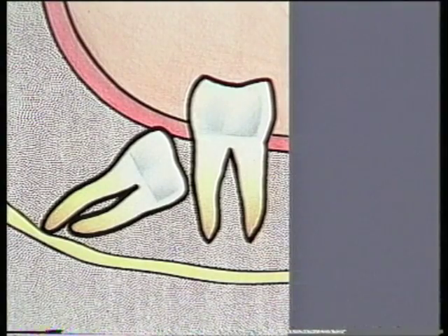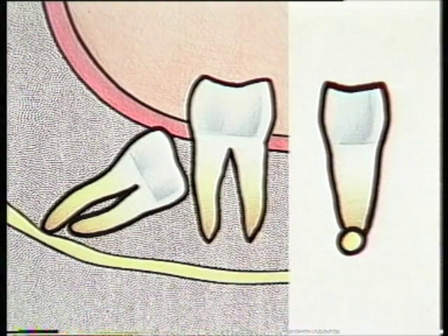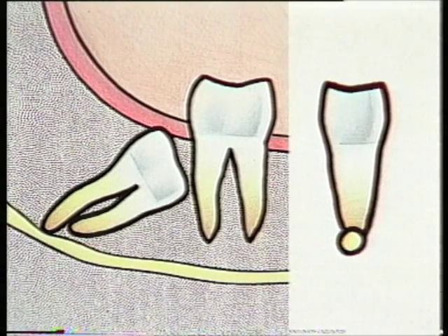A further possibility of the presentation on radiograph is shown in the next diagram. The inferior alveolar nerve has been deflected downwards by the mesial apex of the horizontally impacted third molar. The canal is also somewhat constricted at this point. This again illustrates the intimacy of relationship between the apex of the third molar root and the nerve, and any transmitted downward pressure on this apex will compress and hence damage the nerve.